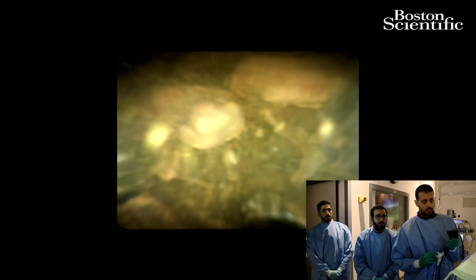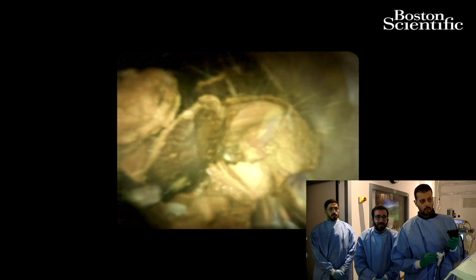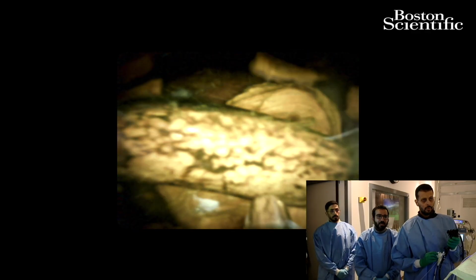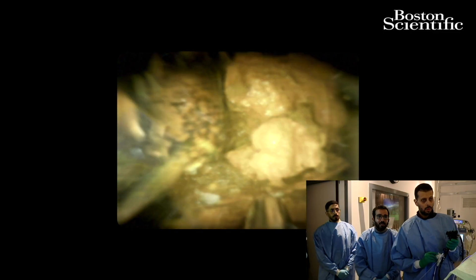Sometimes when the catheter is difficult to get out from the cholangioscope, we had to bring the cholangioscope out from the CBD, and then we advanced the catheter and went smoothly until the tip of the cholangioscope. And then we cannulated the bile duct with the cholangioscope loaded with the EHL wire.